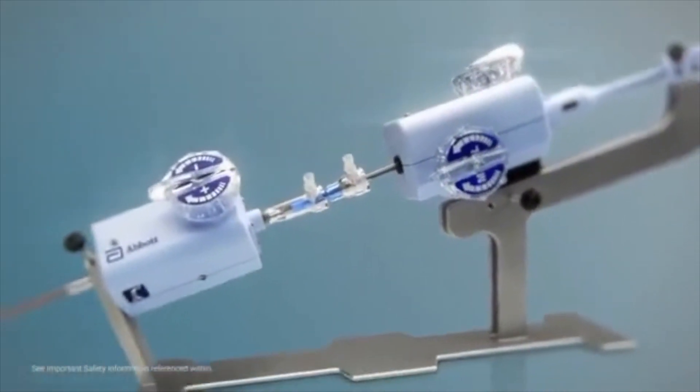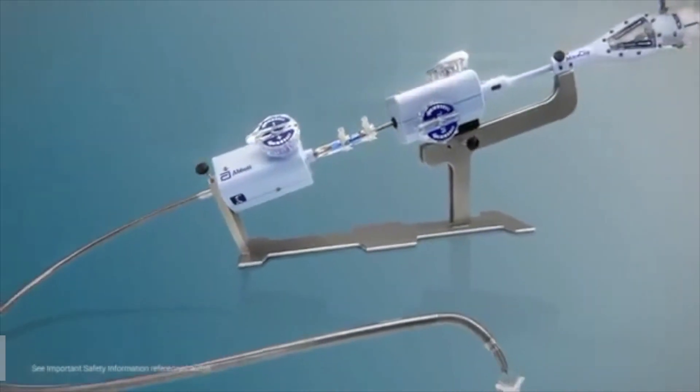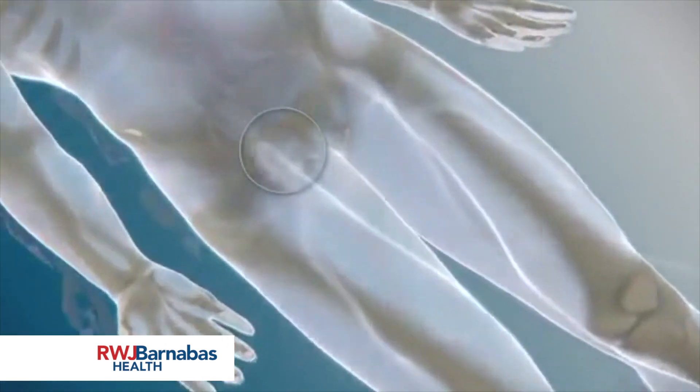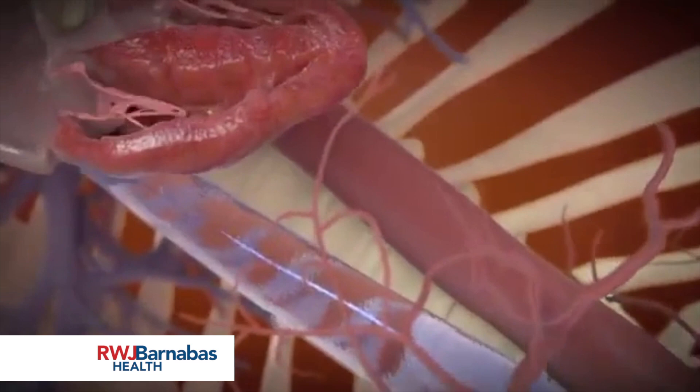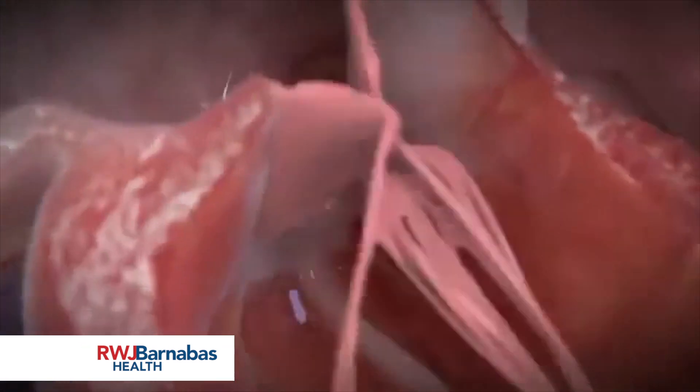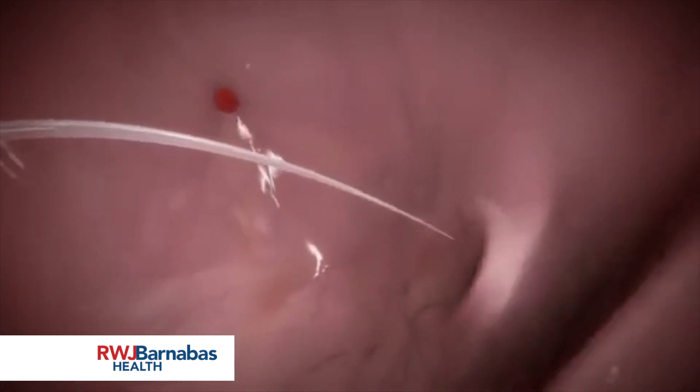MitraClip is a unique, highly manoeuvrable transcatheter system for mitral valve repair. This procedure avoids cardiopulmonary bypass using a minimally invasive venous approach and transeptal puncture to gain access to the left atrium.